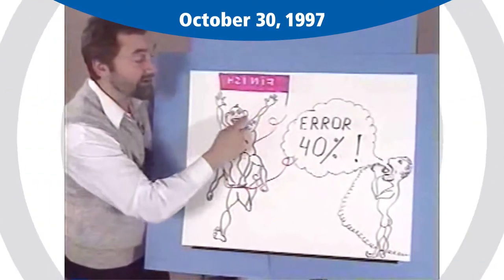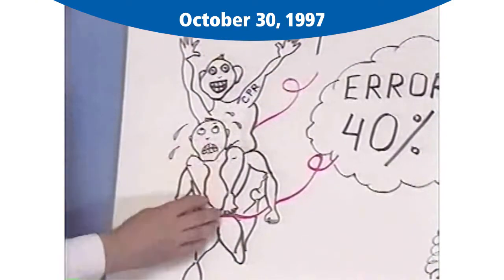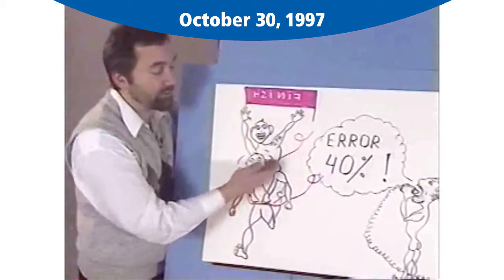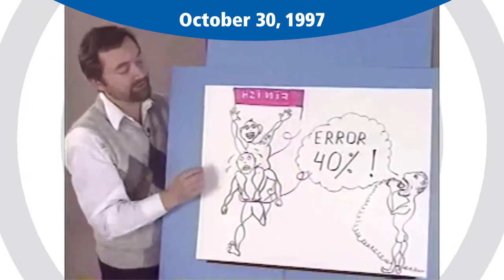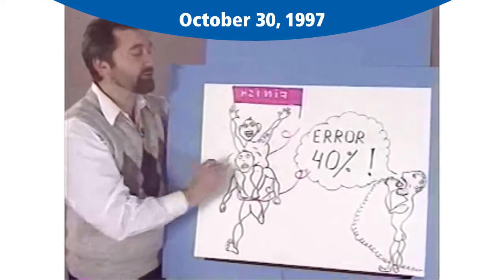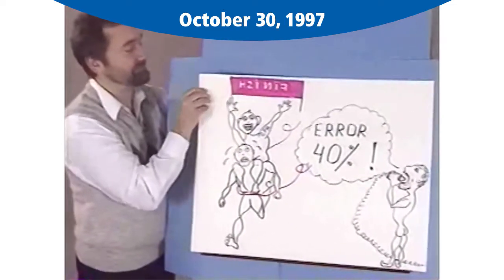That cardiopulmonary circulation will jump onto the artificially created recirculation and compromise our measurement. We will not know what we measure, and the error may be huge, 40%. For this purpose, this hemodialysis monitor has a special method developed to separate these two events, to protect our measurements from the influence of cardiopulmonary circulation.